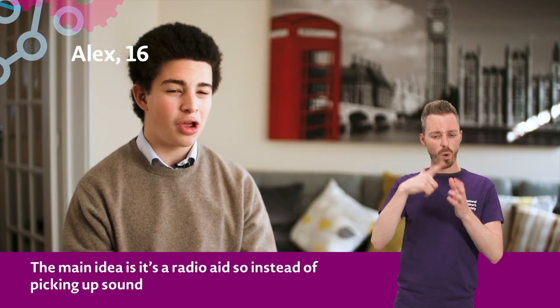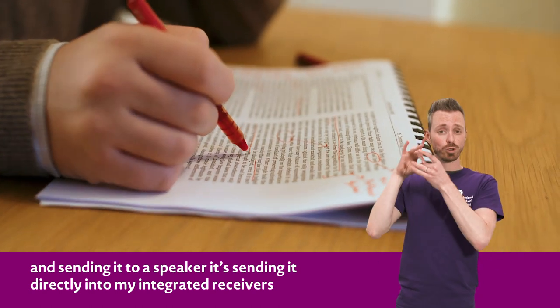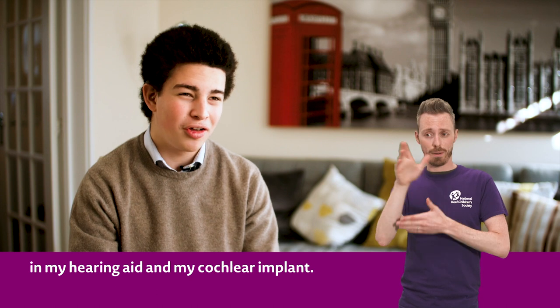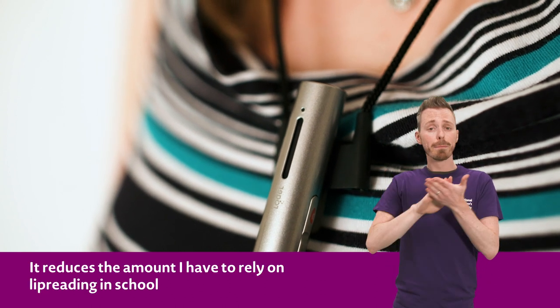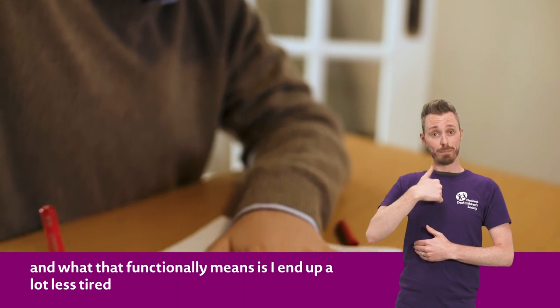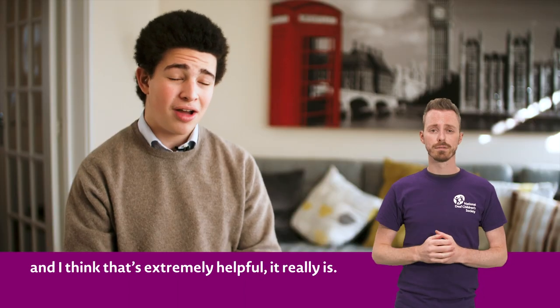The main idea is that it's a radio aid, so instead of picking up sound and sending it to a speaker, it's sending it directly into my integrated receivers in my hearing aids and my cochlear implant. If I'm sitting 20 metres away at the back of the classroom, it's as if I'm standing right in front of someone. It reduces the amount that I have to rely on lipreading in school, and what that functionally means is I end up a lot less tired — and I think that's extremely helpful, it really is.